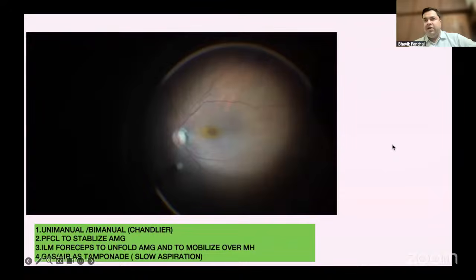Chintan, the point here is not about that. We are not going into the technical aspect of why this is closing or not.